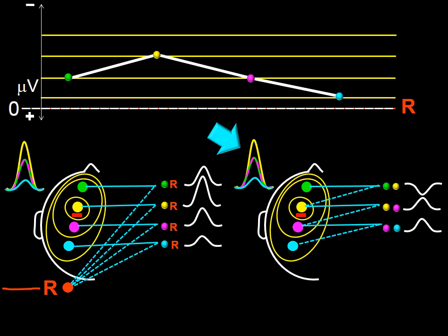That is so because both are collected from the same fictitious neutral point. Also notice that the waves pointed by the arrow are the same as those recorded using a fictitious neutral reference.